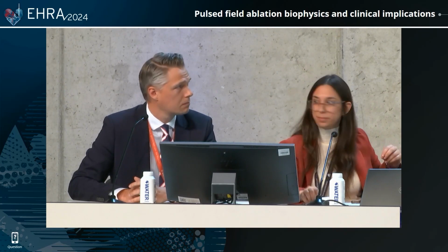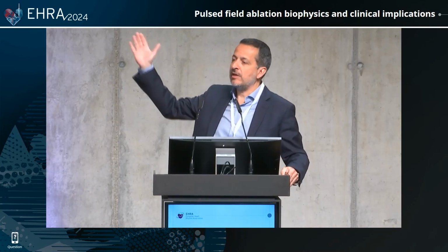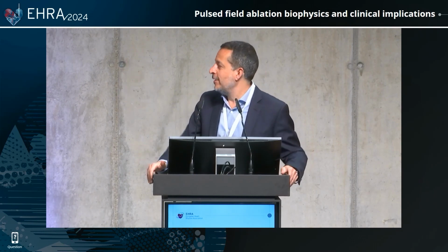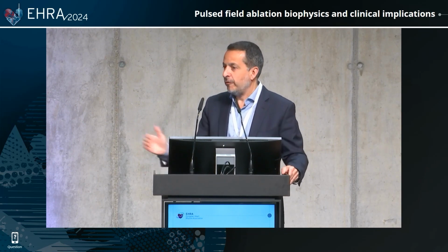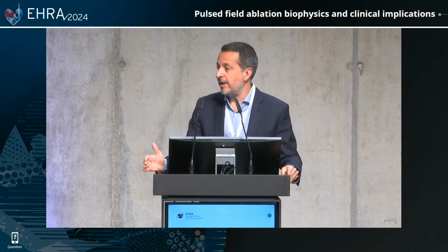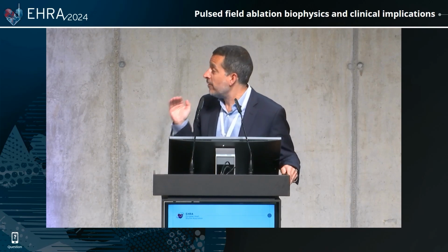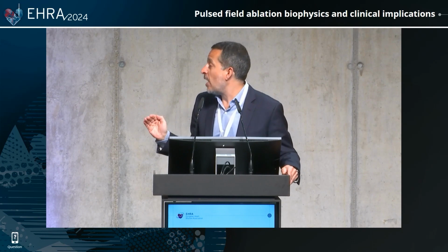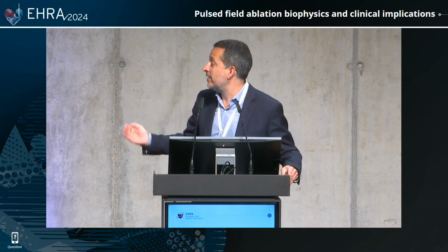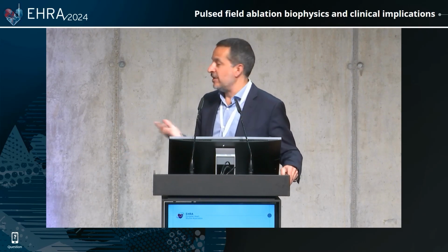Yeah, definitely. And the problem is that with this type of investigation, when you have a clinical presentation, doing a case, you say, okay, you see, all our signals have disappeared. We have the pulmonary vein isolated. Because, of course, they're going to be isolated. Acutely, they are isolated. But 2 hours later, we don't know exactly. And actually, the problem is that it's not only 2 hours. We can even have to wait 24 hours in order to see what happened. So acutely, we cannot say anything.